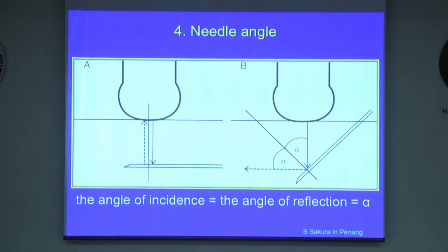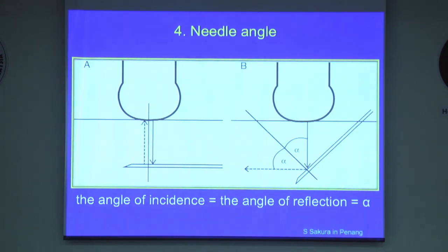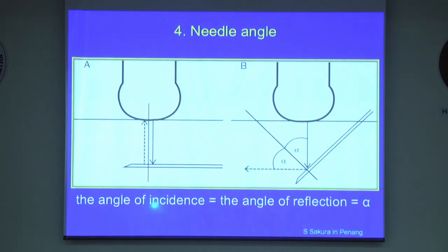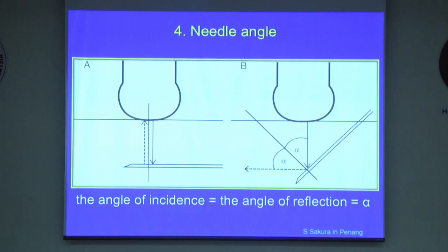Because the conventional needle has a smooth surface, it behaves like a mirror, and the needle insertion angle is very important. As you know, the angle of incidence equals the angle of reflection. So visualization is best when the angle of incidence is zero, but becomes poor at steep insertions because the echoes are reflected away from the transducer.